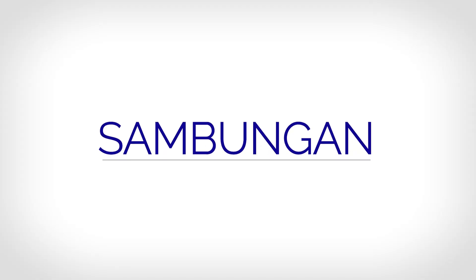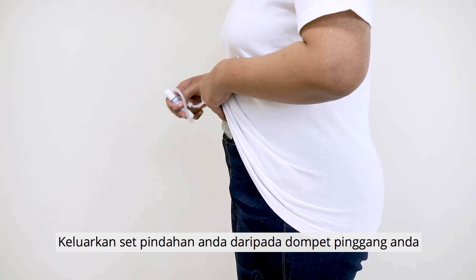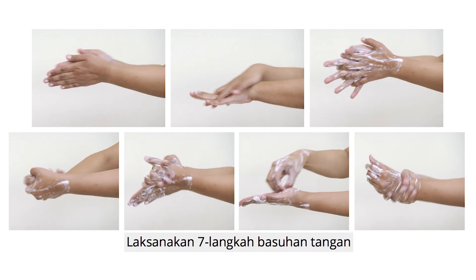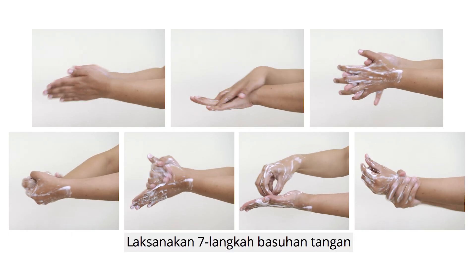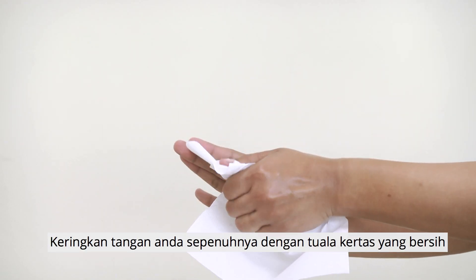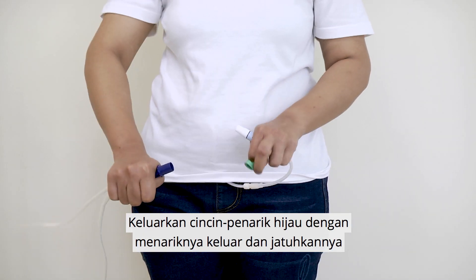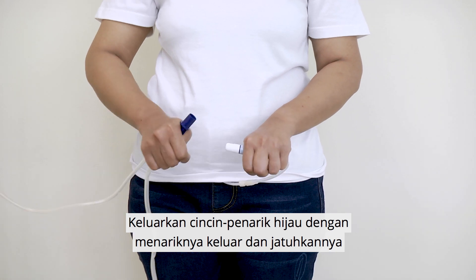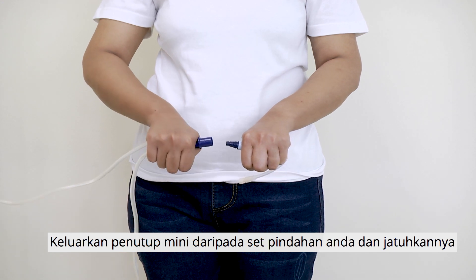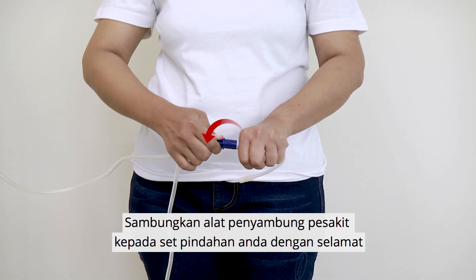Connection. Take out your transfer set from your waste pouch. Perform the seven-step hand washing, then dry your hands completely with a clean paper towel. Remove the green pull ring by pulling it outwards and dropping it. Remove the mini cap from your transfer set carefully and drop it. Connect the patient connector to your transfer set securely.